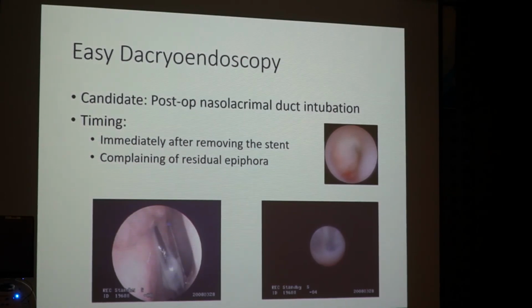In Japan, therapeutic dacryoendoscopy, such as SEP and SGI, is very popular and very widely distributed. So nowadays, we seldom see this kind of patient.